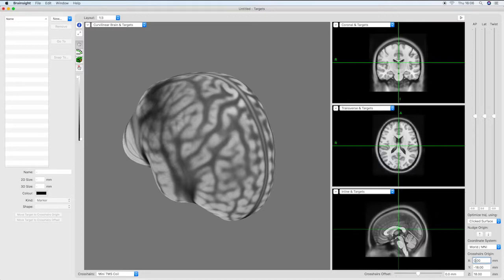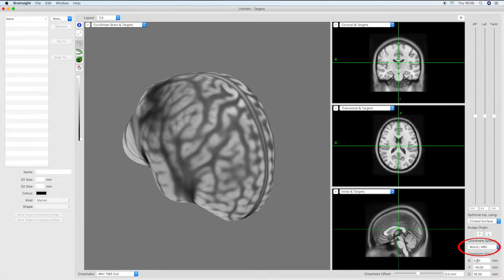Before inputting your coordinates it is necessary to select the correct coordinate system from the drop down menu in the bottom right hand side of the screen. Given that we are using MNI coordinates in this example we will keep the world/MNI option that is currently selected.